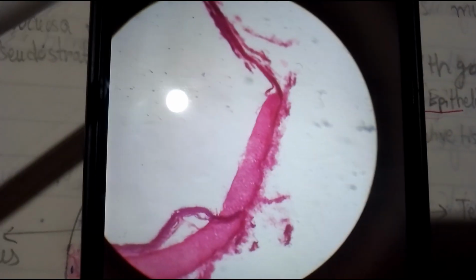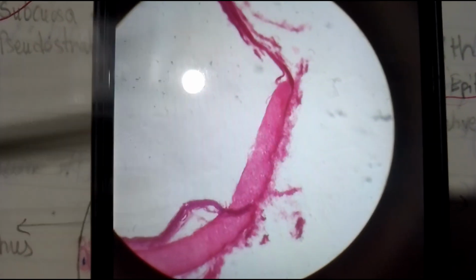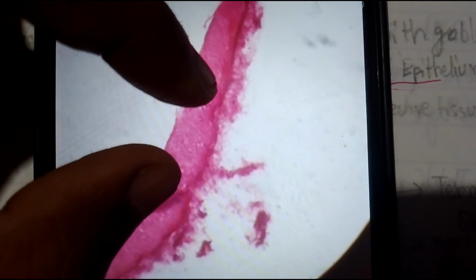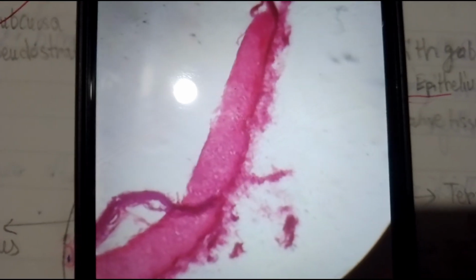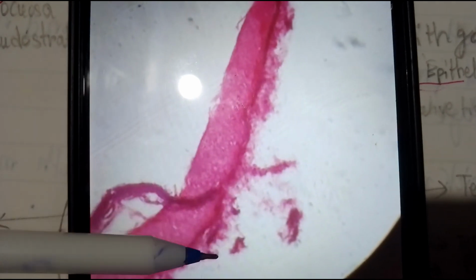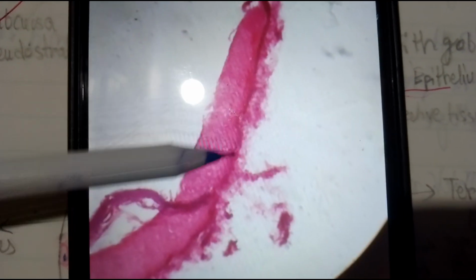Now we see the histological slide of the trachea. As we can see, the lining epithelium is ciliated pseudostratified columnar epithelium. I'm zooming in. This is not so clearly visible, but a little bit there, the pseudostratified columnar epithelium, and this glassy appearance is due to the hyaline cartilage.